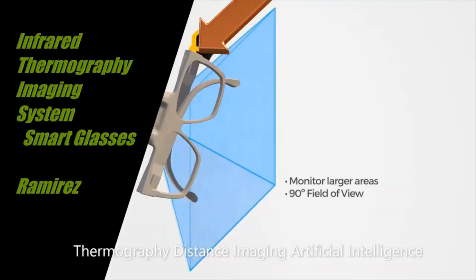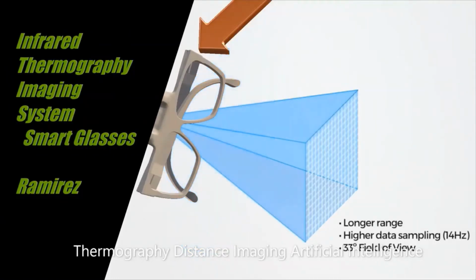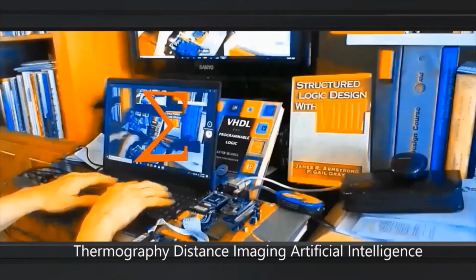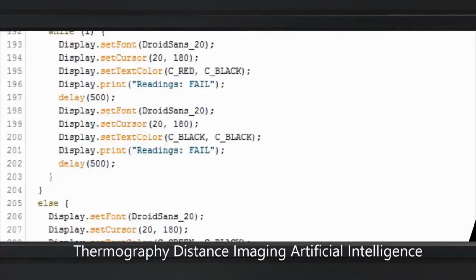A digital signal processor calculates temperature values for each individual pixel and produces the well-known false color image in real time.